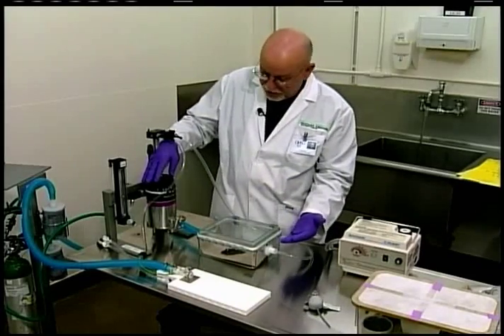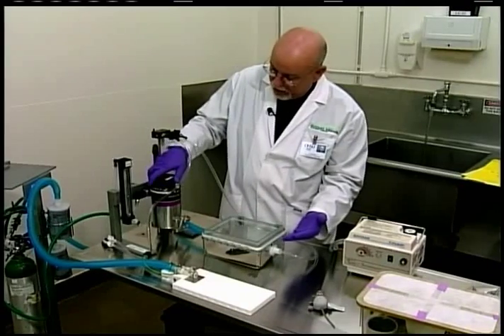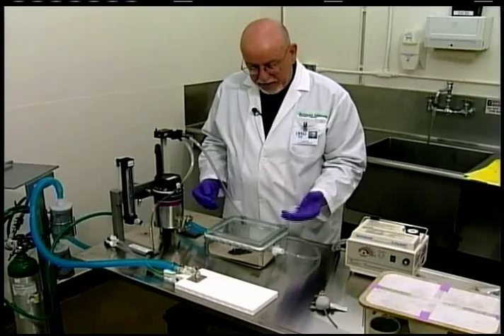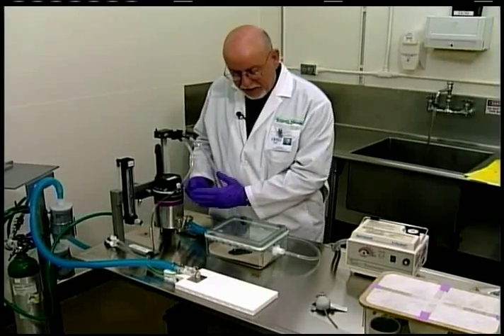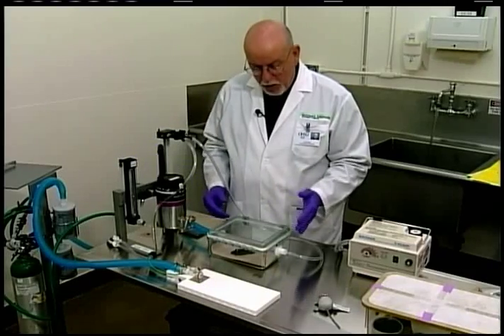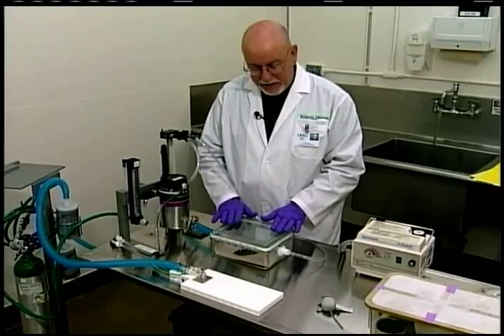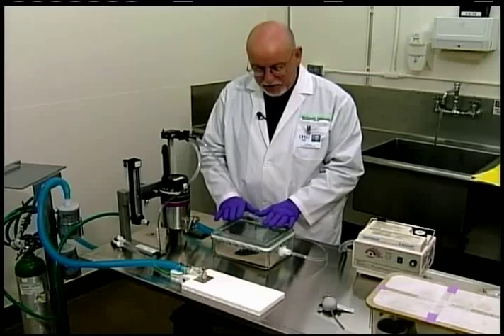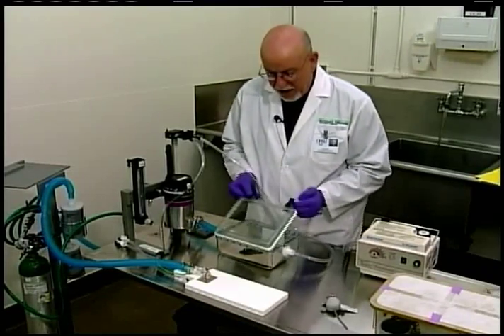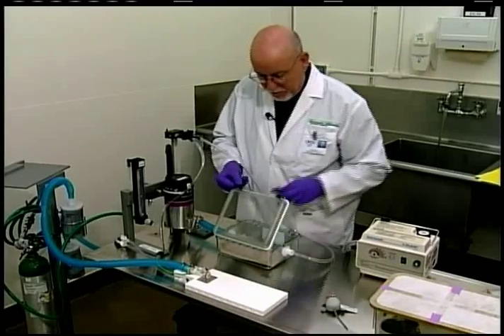Before I open the induction chamber, I like to turn off my vaporizer and allow oxygen to flow for just a few moments to help remove some of that anesthetic that's in the chamber and push it to my waste gas evacuation system. We won't remove all of the inhalant anesthetic out of here, but it just helps a little bit to get some of that gas out of the induction chamber. I have a few moments to work with the animal like that.